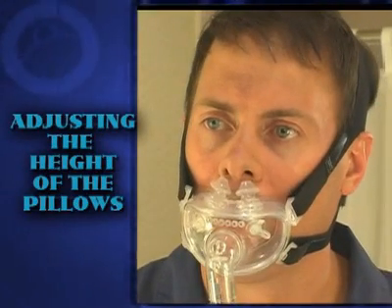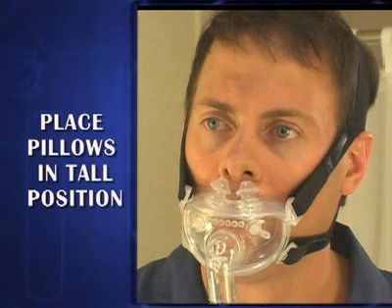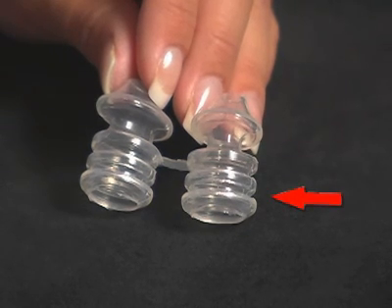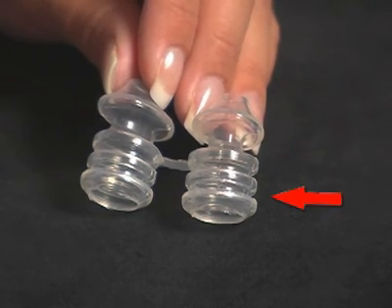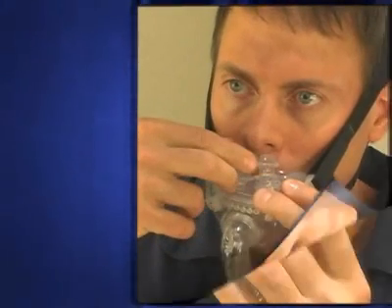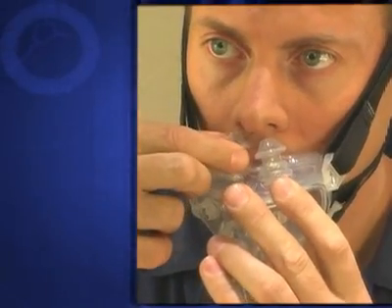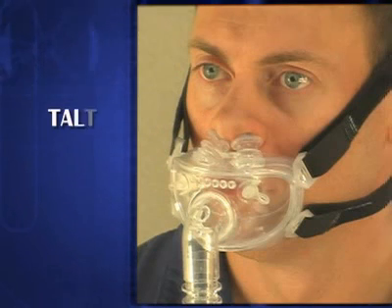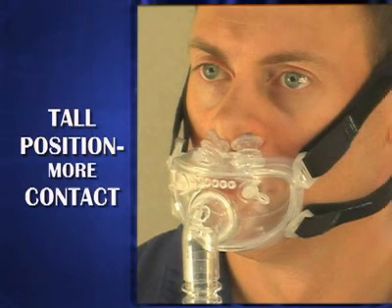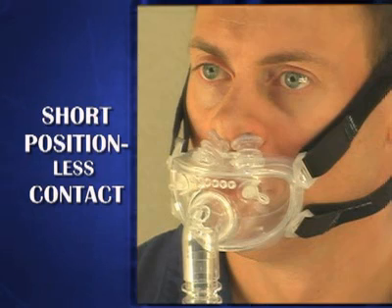If your nasal pillows are not maintaining adequate contact with your nose, place the nasal pillows in the tall height position by using the lower grooves located on each pillow base to affix the pillows to the oral cushion. Remember to use the tall position for more contact with the nose and the short position height for less contact with the nose.